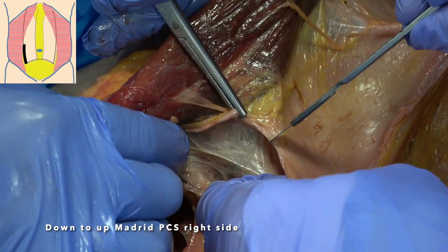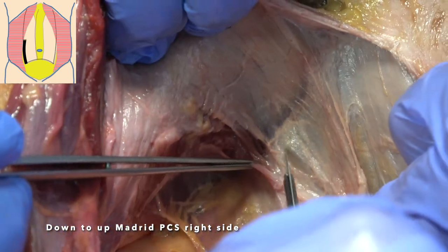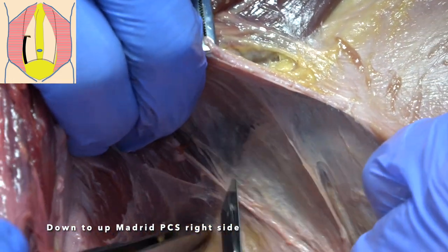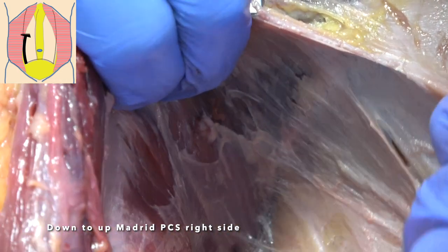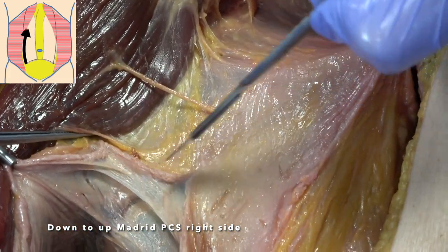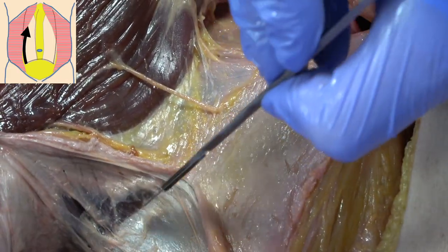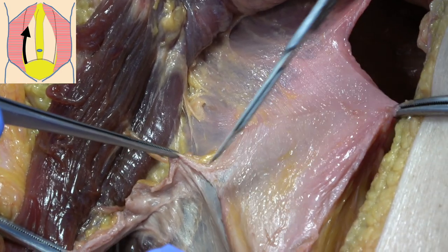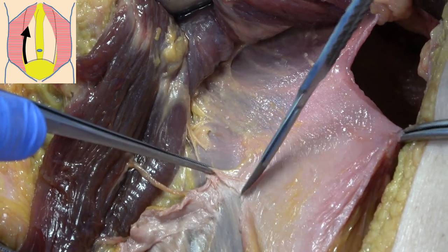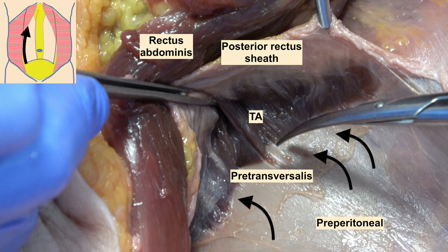As soon as we incise the first centimeters, we extend laterally the dissection in a periperitoneal plane behind the transversus abdominis muscle. At this level we keep the fascia transversalis attached to the transversus abdominis muscle. This lateral extension releases the tension on the peritoneum, preventing tears. Here we check that from the umbilicus we follow the myofascial limit of the transversus abdominis muscle in order to cut only the insertion of the muscle on the posterior rectus sheath. Precisely, this is the part of the abdomen where the peritoneum is thinner and more stuck to the posterior rectus sheath.